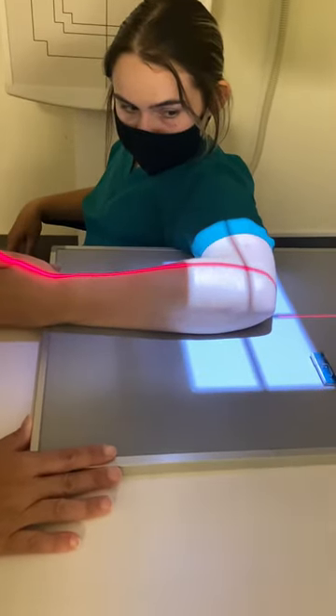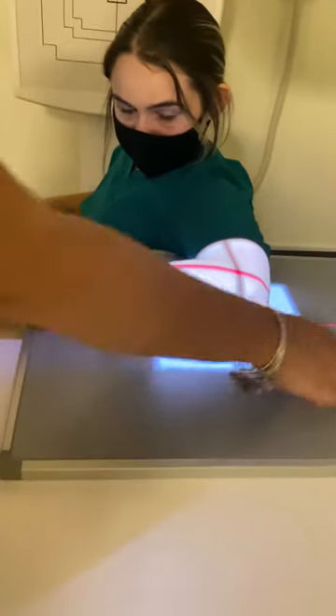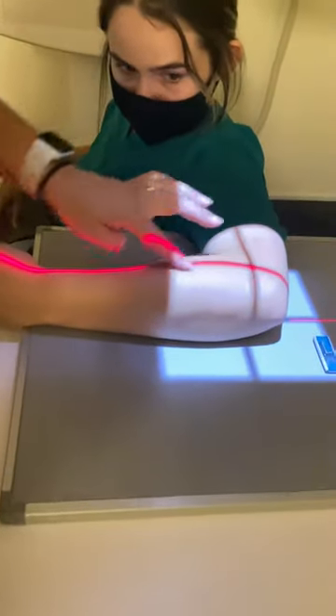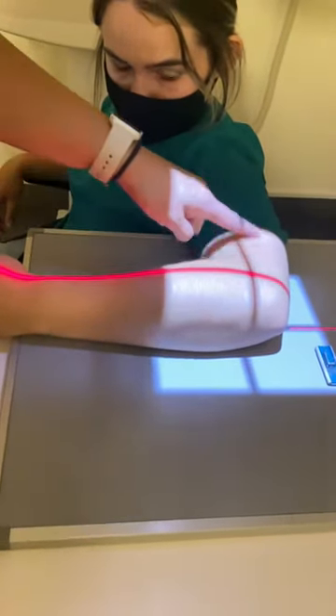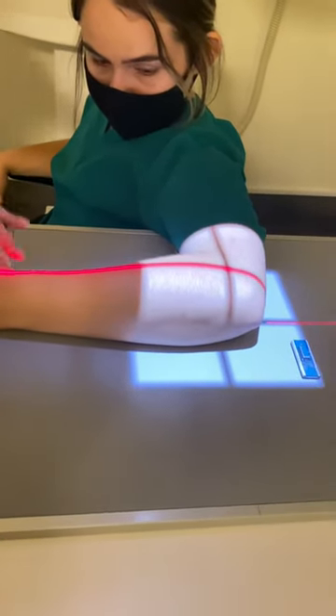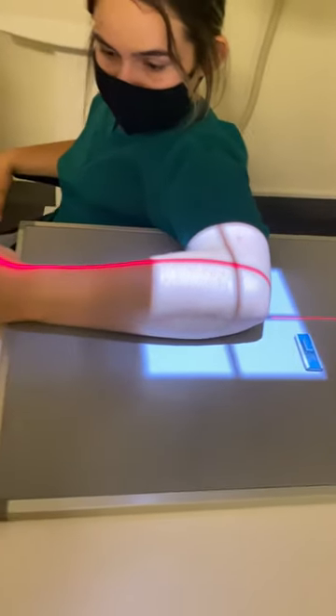I'm going to move that just a little bit. I should have the central ray line coming down into the forearm and up into the humerus. The shoulder and elbow are on the same plane, my wrist is lateral, and she's got a true 90-degree bend in her elbow. I'd have her hold nice and still.